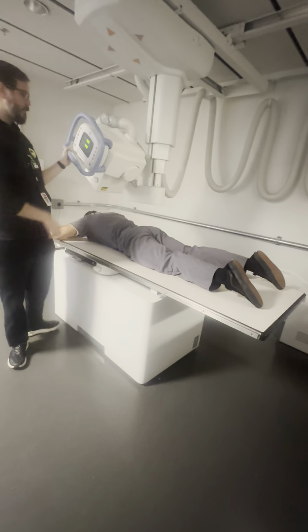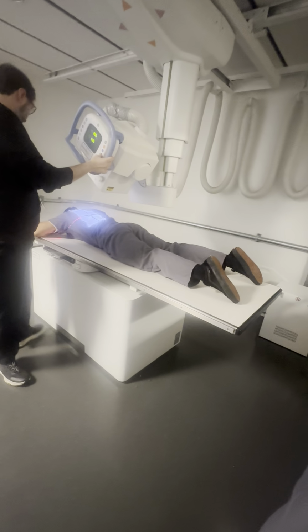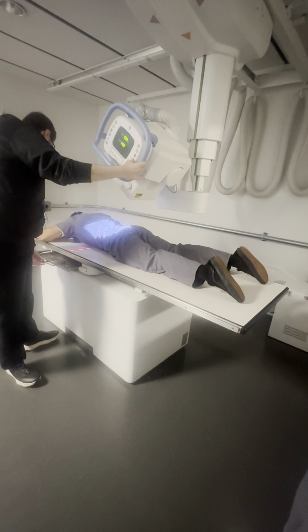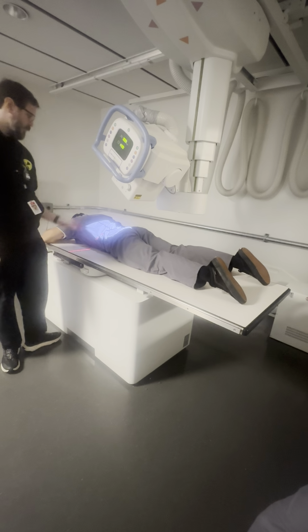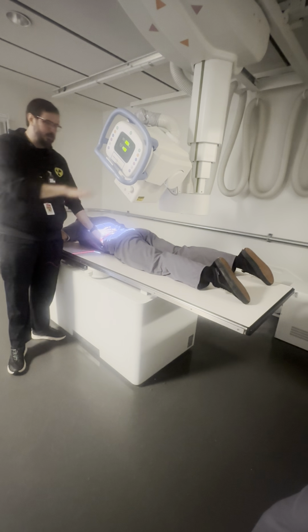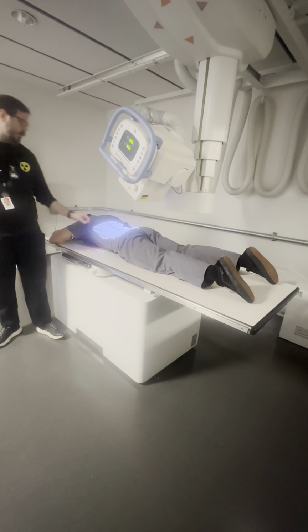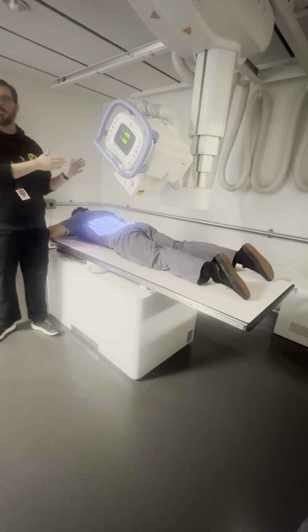Always gotta account for the bucky too, though. Okay, but now I got a match, right? So I'll pull down. This is where it's nice to leave yourself that little extra space on your bucky in case you need to come up a little bit to match it. The centering is going to be exactly the same, but now that I shifted, I need to go back. So what I used to do is I would take my marker and put it where I was happy with the PA position. That way I can just slide back to that point.